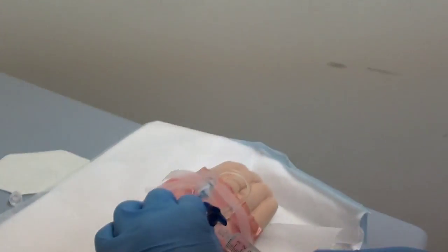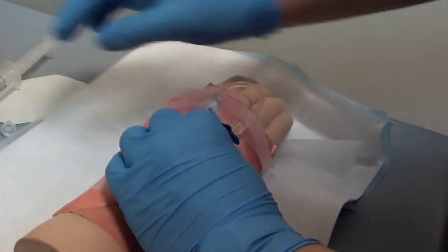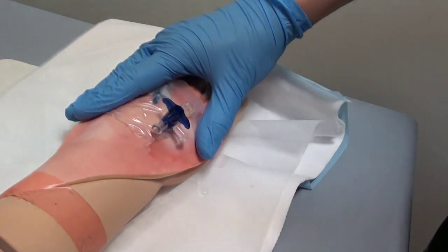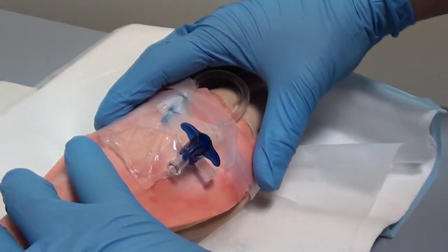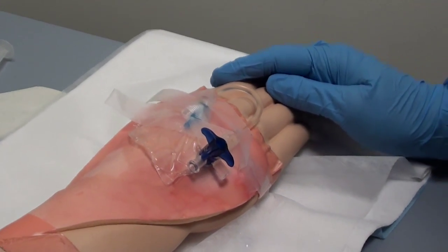Just now turn that three-way around to clamp it off. It's a nice puck and all the tape down to secure this all beautifully in place. And now we're ready to insert drugs or give some fluid through that line.